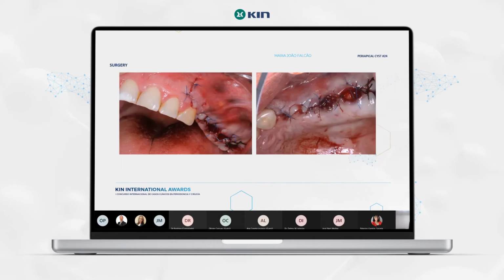with nylon 5-0. We tried to close everything by first intention. The most important part is, of course, the area near the bone, the regeneration. In the back side, it was not easy to close everything, but that's okay. They are alveoli, so there is no problem.